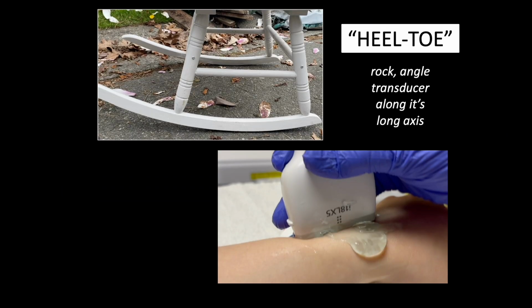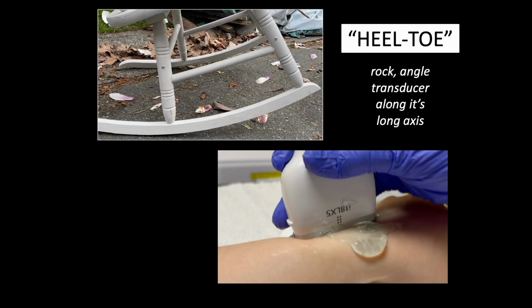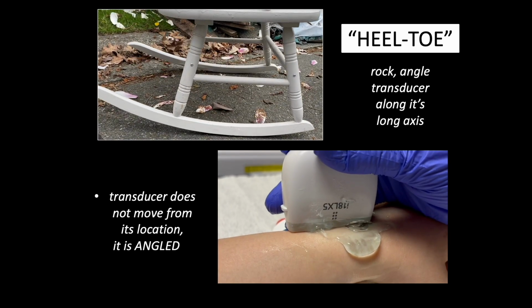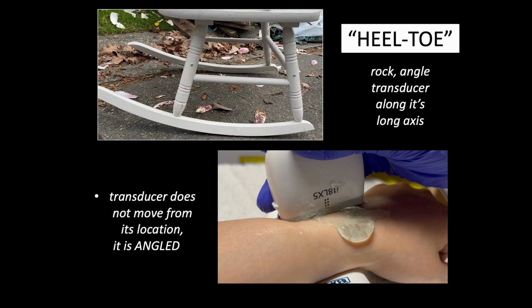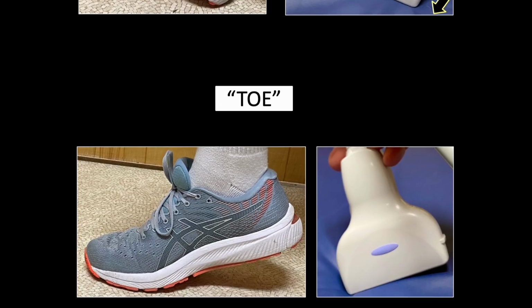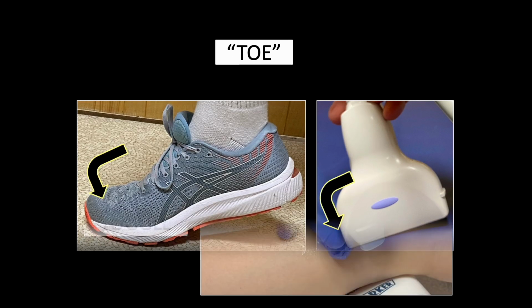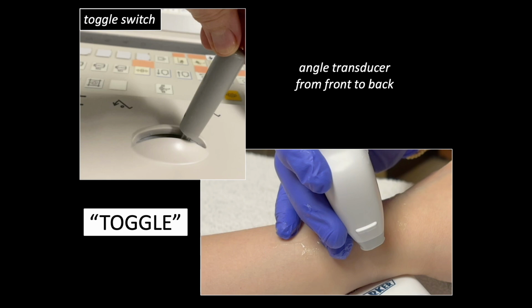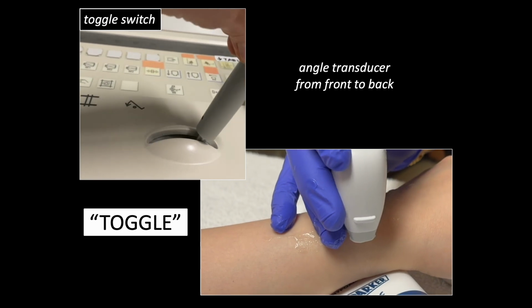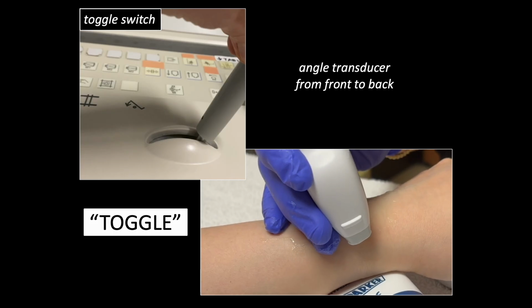When you heel and toe the transducer, you rock or angle it along its long axis. The transducer does not move from its location, it is angled. It would be the heel of the probe, and this would be the toe. When you toggle the probe, you simply angle the transducer from front to back, similar to a toggle switch.